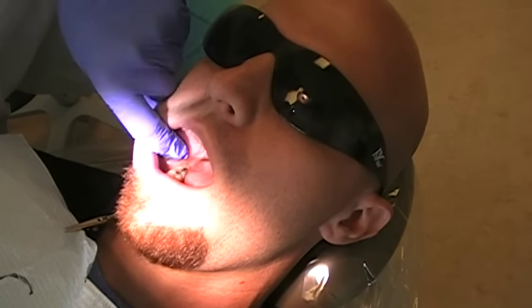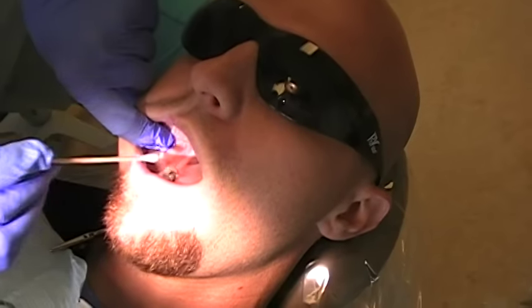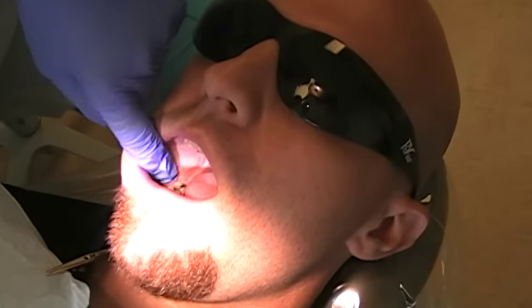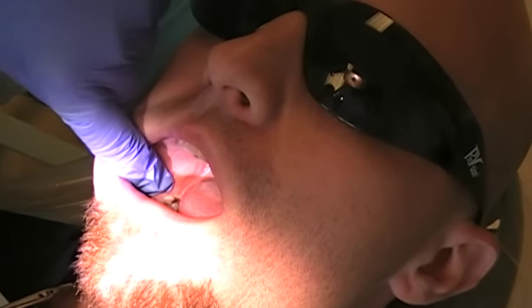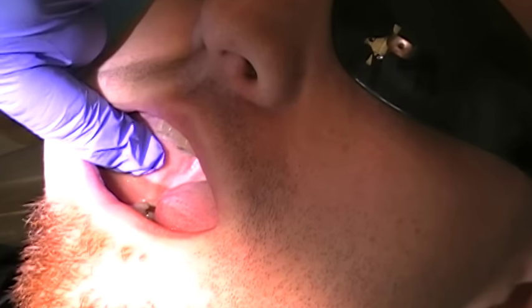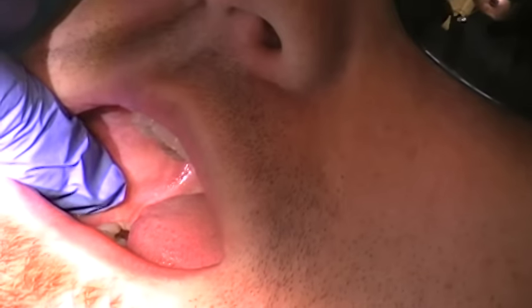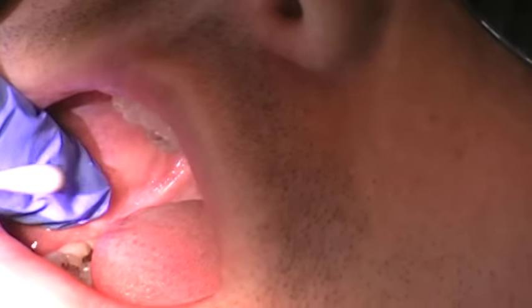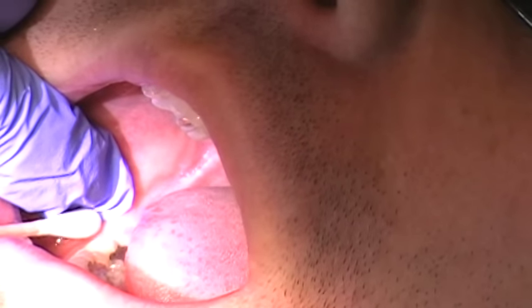We're going to do the IA injection today as well as the buccal injection, and I'm going to show you the landmarks. The first thing is to find the coronoid notch, the deepest part. I'm palpating that and I have found it. Then I'm going to rest my finger on the coronoid notch down onto the internal oblique.